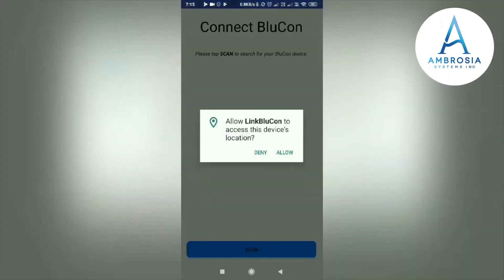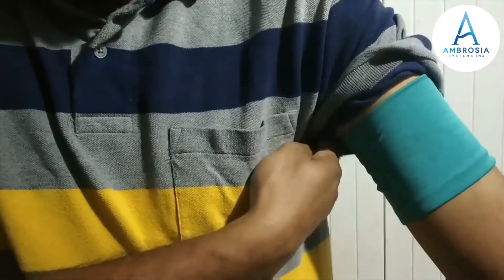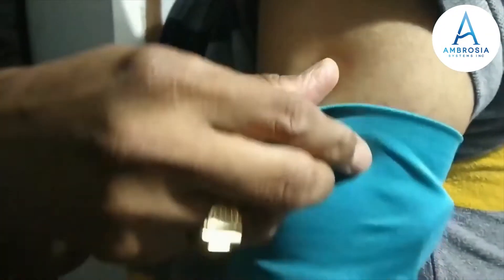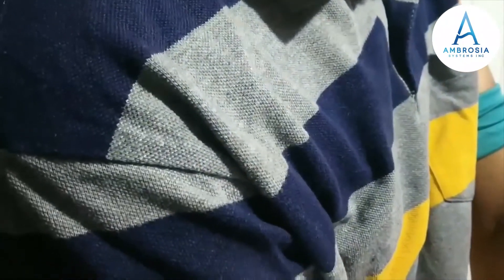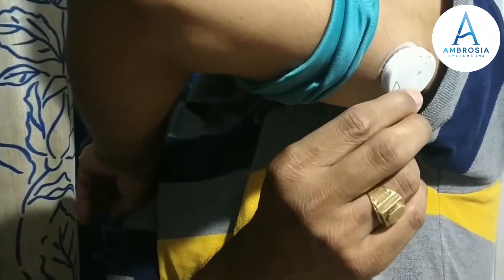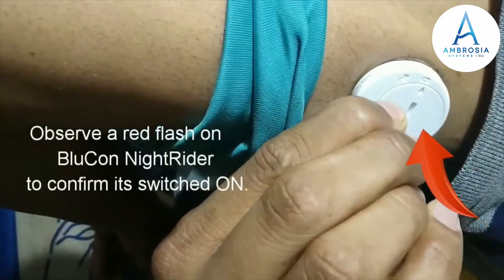Allow a few more permissions. The app is searching for my BlueCon Night Rider device, but before that we need to switch on our Night Rider. In our previous video we installed the BlueCon Night Rider on our Freestyle Libre Pro. My Night Rider is switched off, so let me switch it on using this pin that comes with the Night Rider package. I insert the pin into the hole and click once. You can notice the red flash — our Night Rider is now switched on.